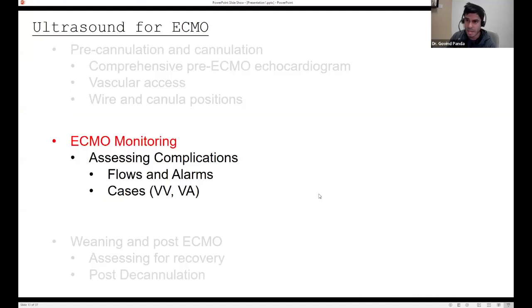So let's talk about using ultrasound for ECMO monitoring, some flows and alarms, and we'll go through some VV and VA cases.